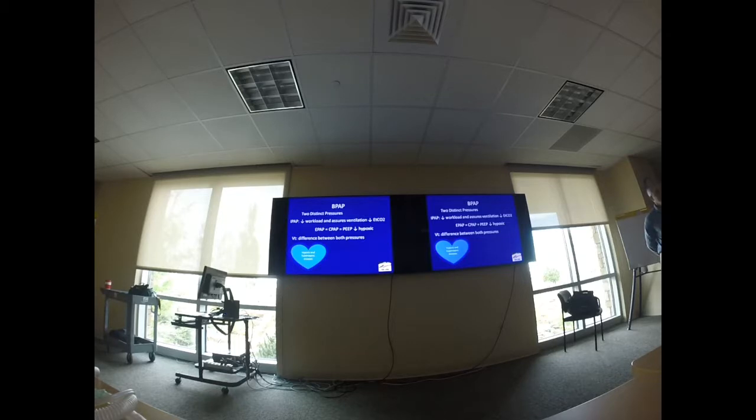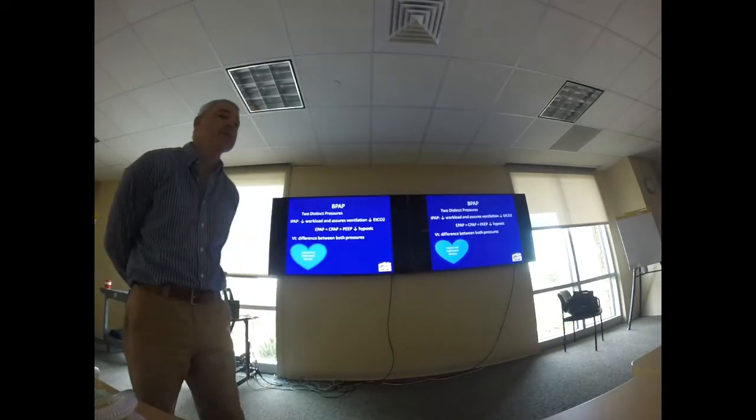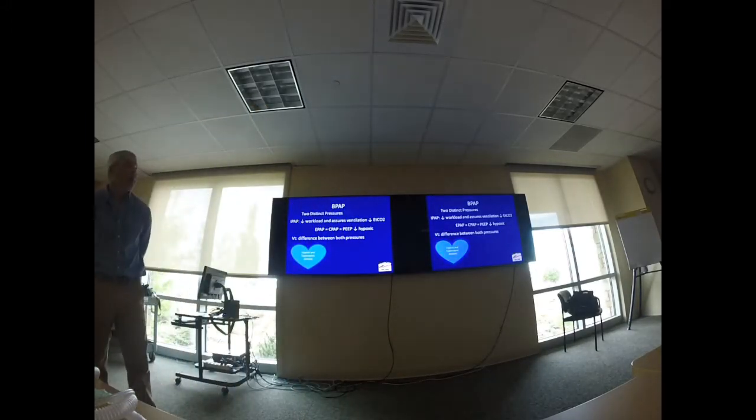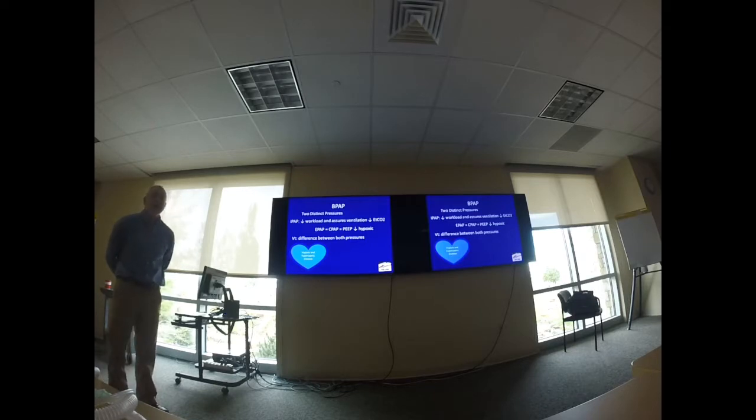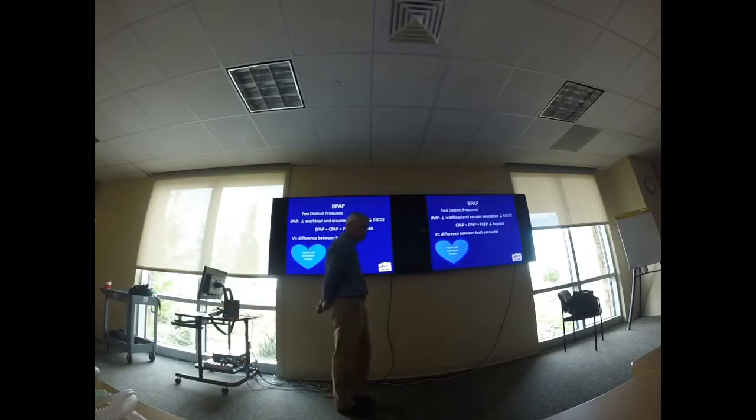CPAP and BPAP, I think, are confusing to transport nurses and transport paramedics because we don't have that respiratory side of us. But knowing that BPAP is used for hypercapnia or mixed hypercapnic hypoxic emergencies, and CPAP is used for hypoxic emergencies is definitely useful for us.